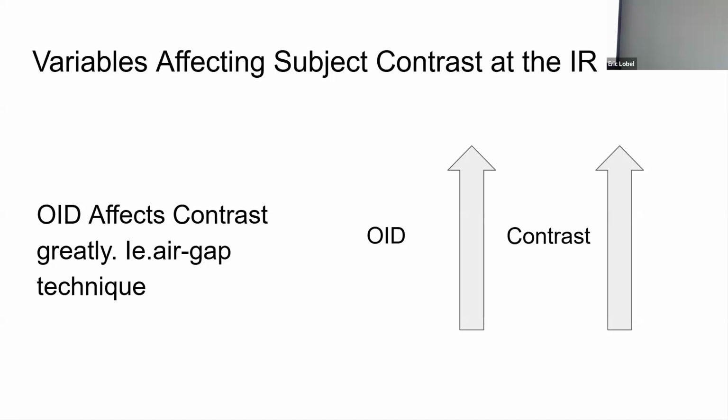Otherwise, most images were marked. Most images were with EI. Very little anatomy was cut. I could have seen some more collimation on a lot of things, but not to the point where I would repeat the exam. There were a few where there was actually too much collimation, and that actually cut anatomy, which is unfortunate because in reality, you were trying to save radiation, but now someone has to do a repeat and add more radiation to the patient. So that defeats the whole purpose. But otherwise, it went pretty good.